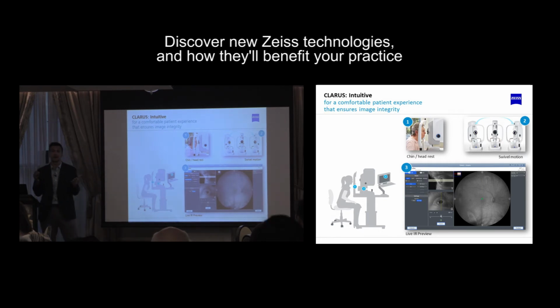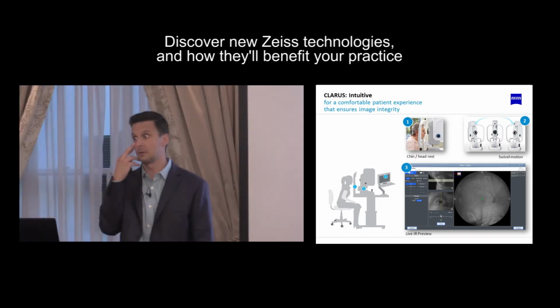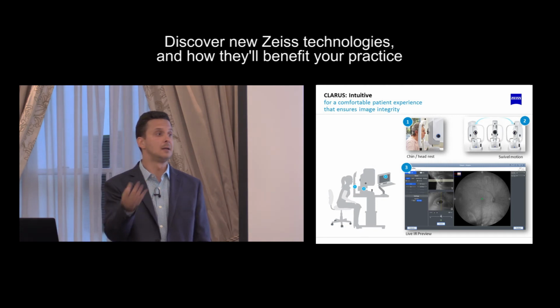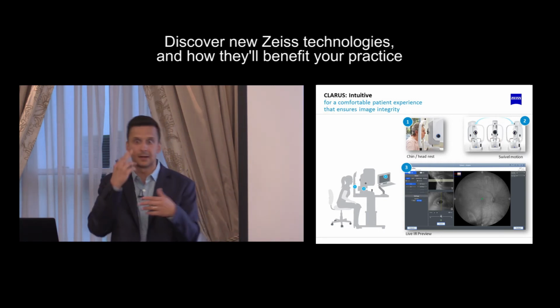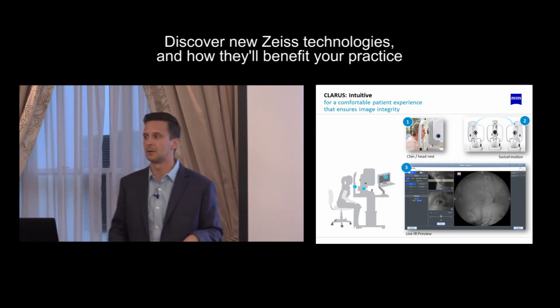Now, with the Clarus, you do have some of the challenge with the eyelash on a more narrow eyelid or a more inset eye. So you just got to be cognizant of that. Again, after about 20 eyes, 10 patients for each of our staff, they got used to where that was and they saw it right away. And we're able to just tell the patient, just pull their eyelid down just a little bit. So from a comfort standpoint, now they don't have to jam their face in there, and maybe there's just a little bit of a pull down that's happening on that lower eyelid.